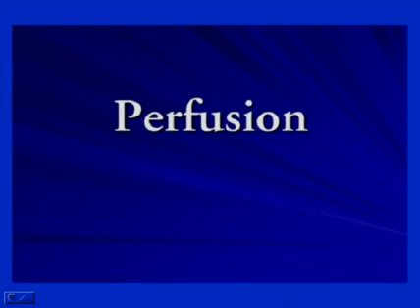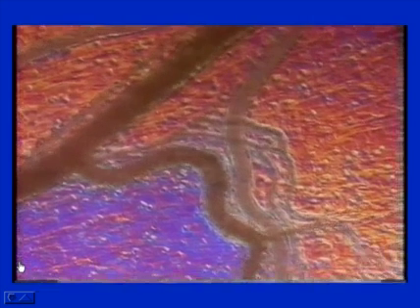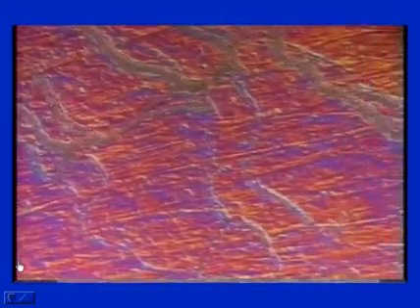This is an intravital picture of tumor perfusion, showing some of the RBCs inside of the rat mesentery, and the arteries next to the veins, as you can see there. But this is the level that we're imaging with the microbubbles.